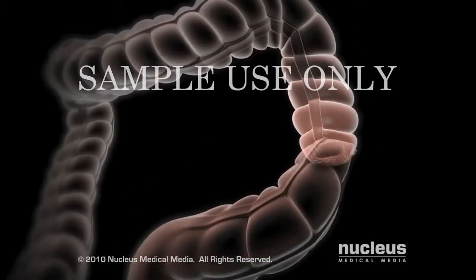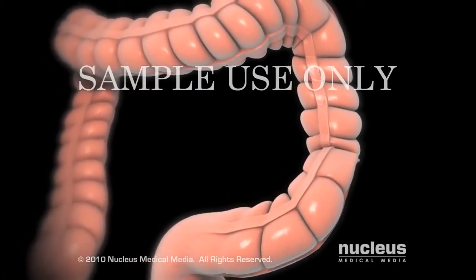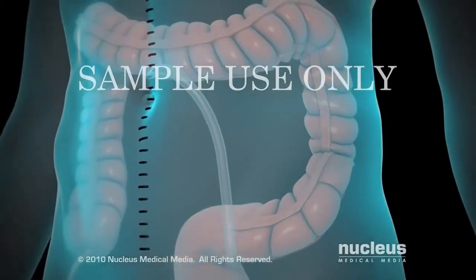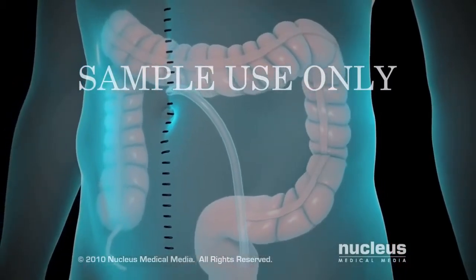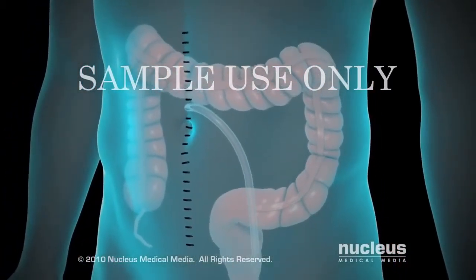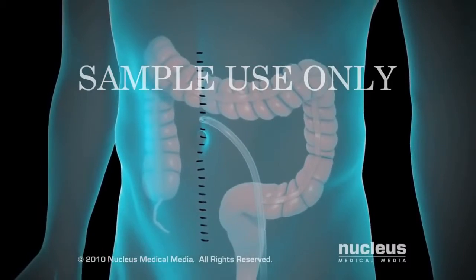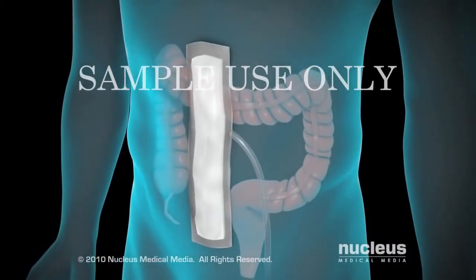After your surgeon has completed the procedure, he or she will insert one or two drains to collect fluid that may accumulate around the surgery site, close the wound with sutures or staples, and cover it with bandages.